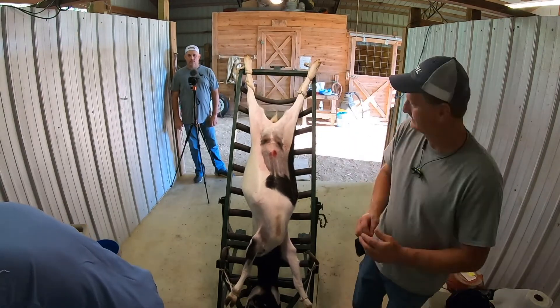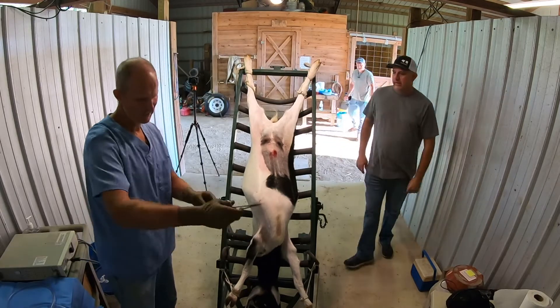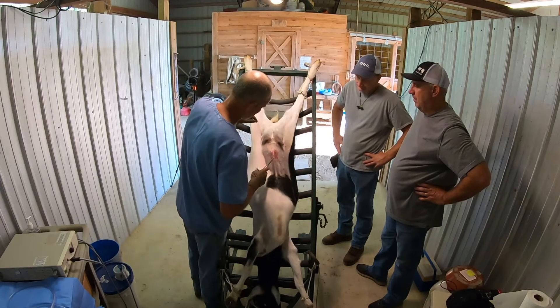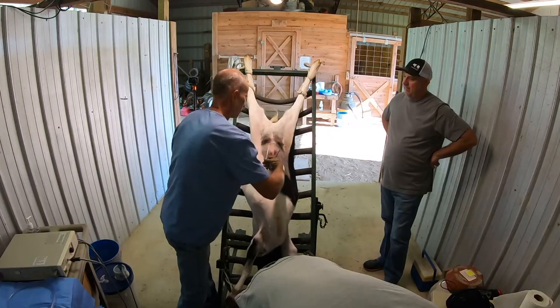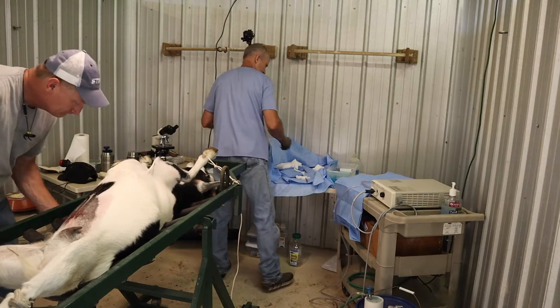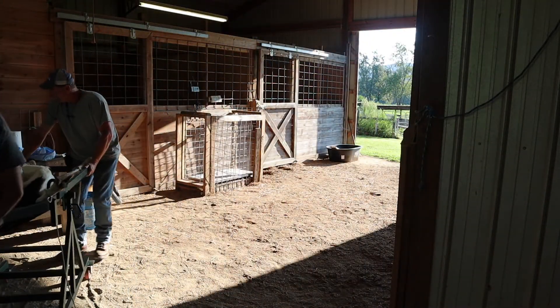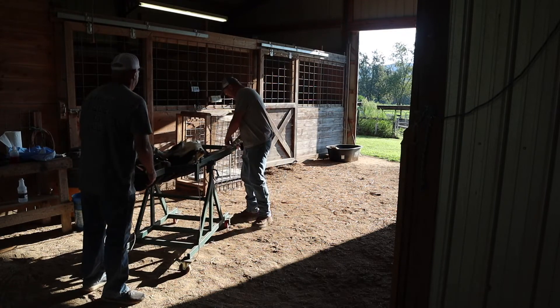I prefer to put a couple of sutures across here. I don't necessarily think you have to, but for me it just makes me feel better — one absorbable suture across. We won't have to take it out or anything; it'll just come out on its own. Just makes me feel better. All right, let's get her back upright. We'll put her in this stall right here to recuperate.